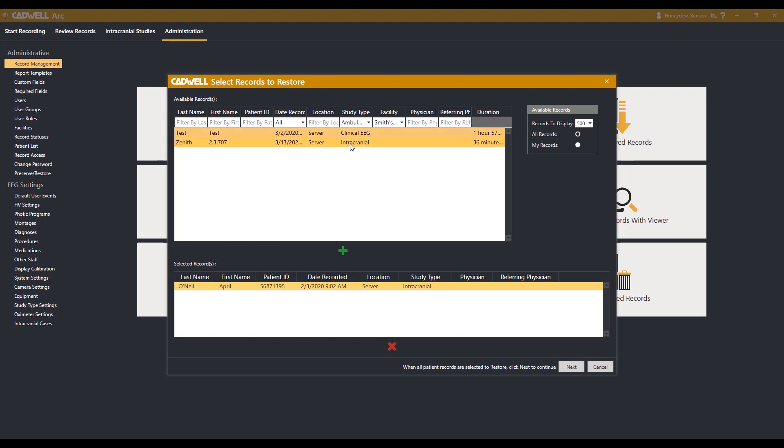When you have selected the studies you would like restored, hit the green plus in the middle of the window. This will add them to the list of studies to be restored.